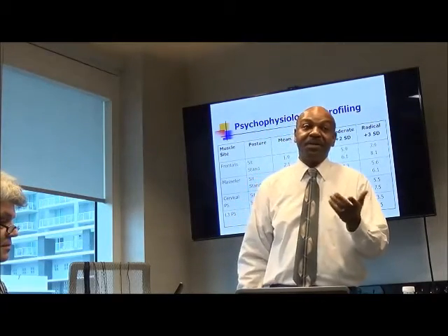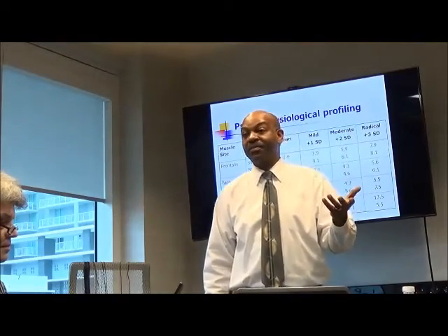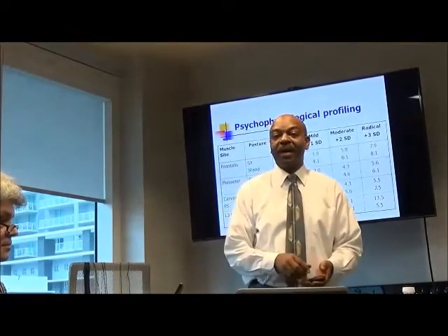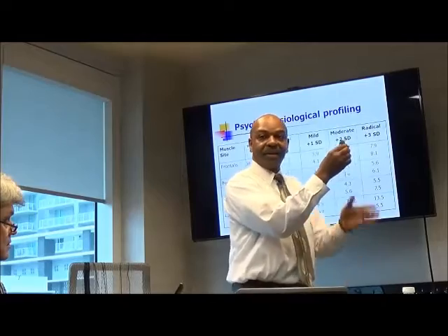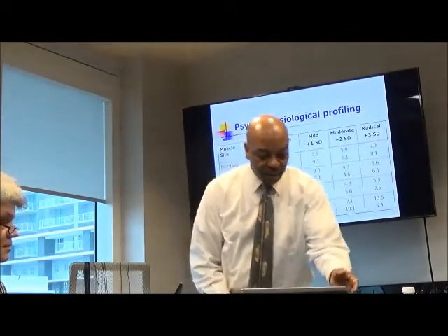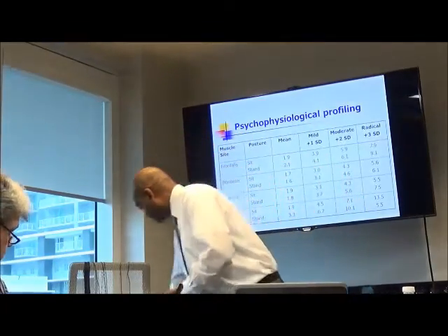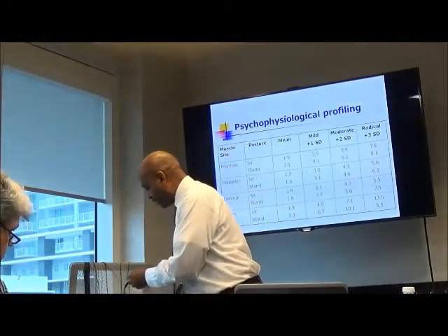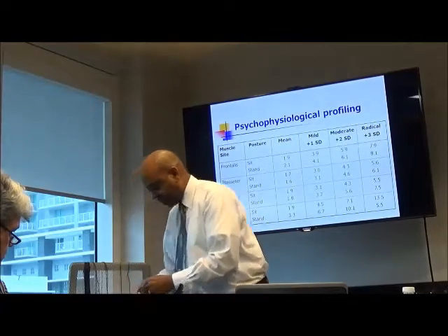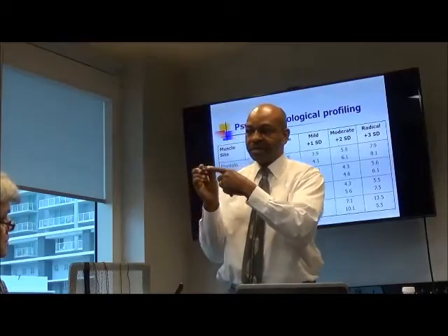But also, if you're not doing the test properly, it can give you false readings. So let's say I'm holding the EMG sensors that we've been using. I don't have it here now, but that's okay. If you imagine, you have this part that has the sensors on it.